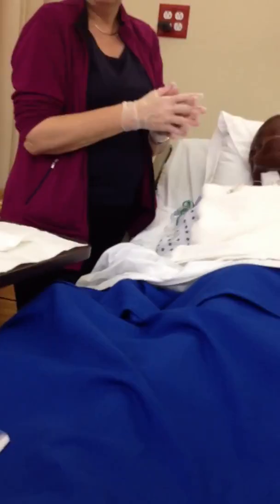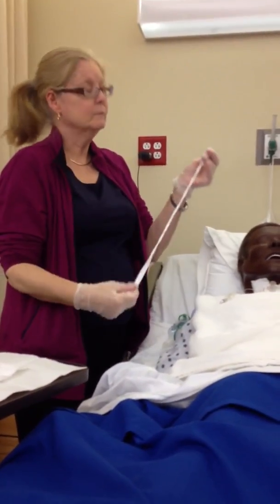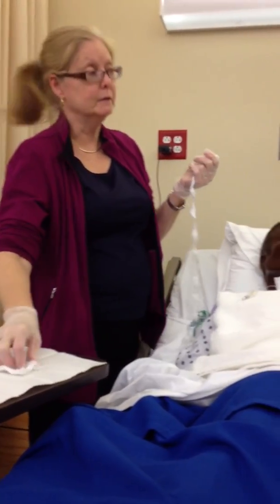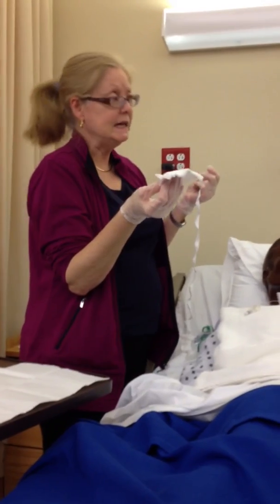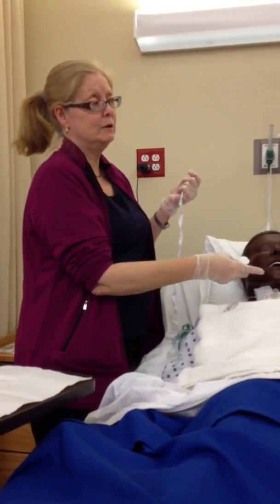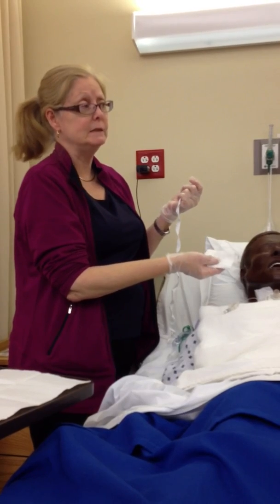After we, say there's some dried secretions around that, we can use a 4x4 that's soaked in normal saline? Or the 50/50? Yeah, normal saline usually. You don't want to use too much peroxide on the skin, because, you know, again, it can bubble and everything. So if you can get it off with saline, that's always better.